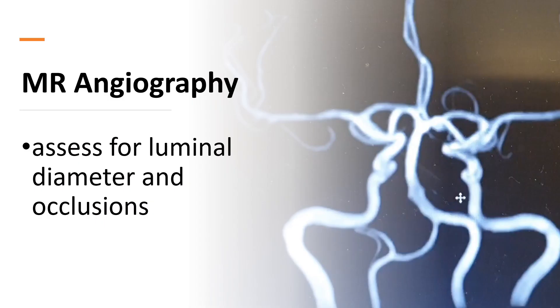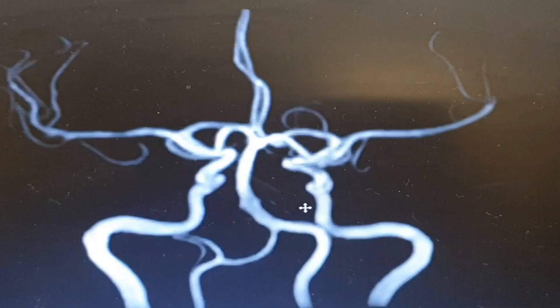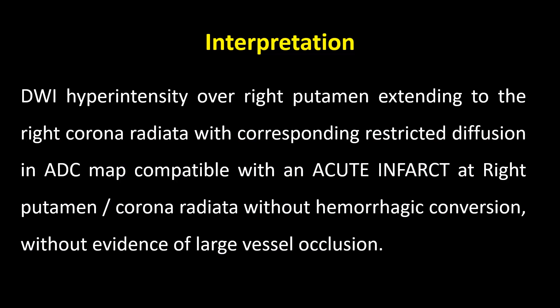MR angiography may demonstrate luminal diameter, occlusion, or stenosis. When interpreting the MRA, one must correlate the site of infarction with its corresponding blood supply. For this case, the right putamen is supplied by the anterior circulation, particularly the middle cerebral artery. In conclusion, there is a DWI hyperintensity over the right putamen extending to the right corona radiata with corresponding restricted diffusion on ADC map, compatible with an acute infarct at the right putamen and corona radiata, without hemorrhagic conversion and without evidence of large vessel occlusion.